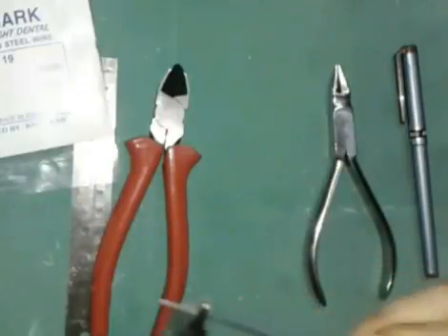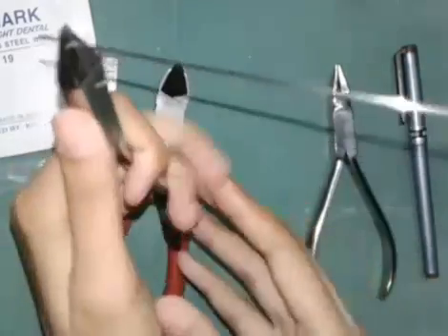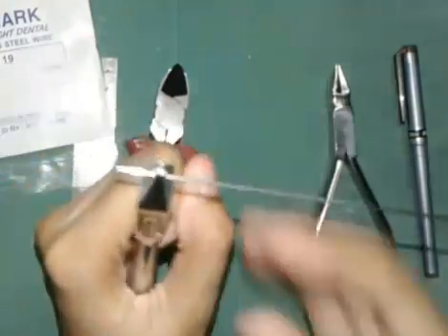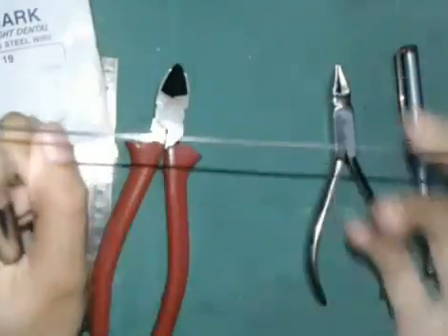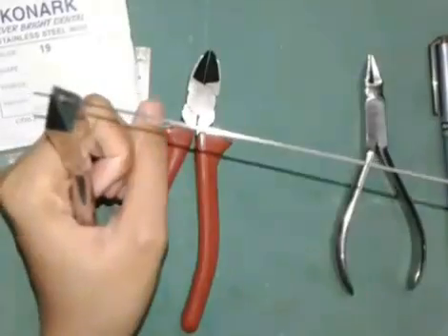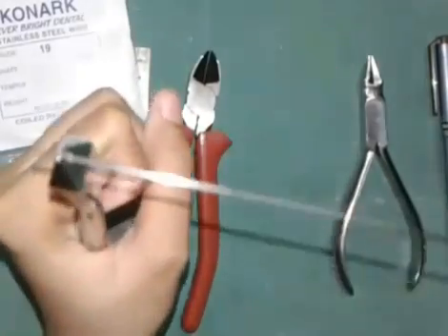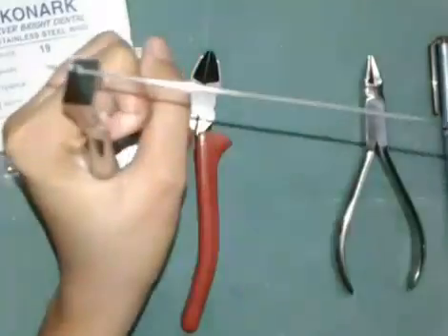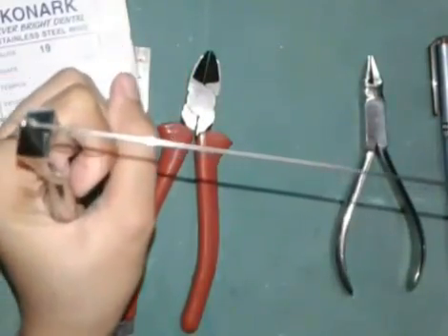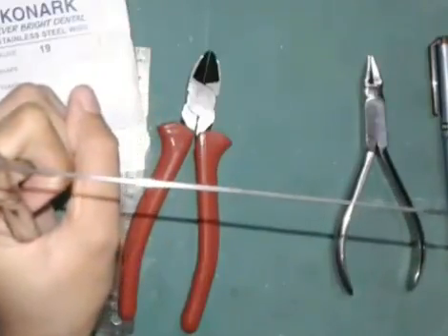First of all, we want to hold the plier firmly to assist the wire bending. That is the first principle. We want to hold the plier with the palm grasp. We want to hold it like this, firmly. This is the second principle in wire bending.